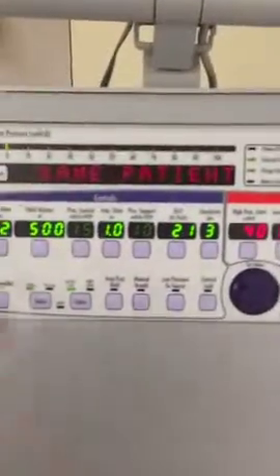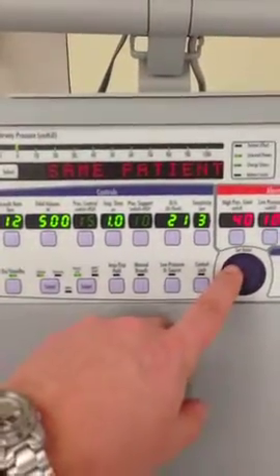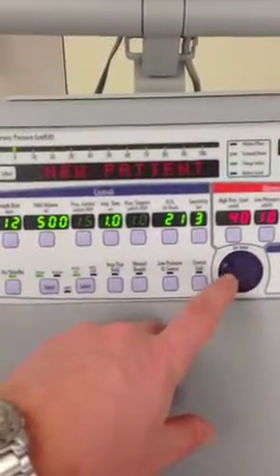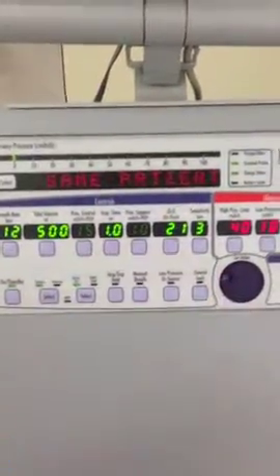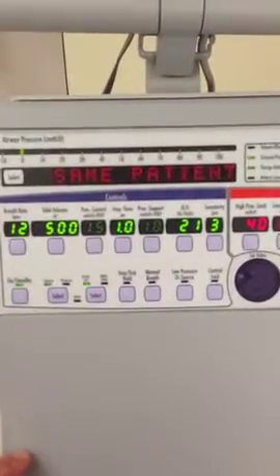Now I've got a choice. If we look in this display window, right now it says same patient. I can select my same patient, or I can select new patient by using this dial here at the bottom. If it's the same patient, you're going to be able to see what ventilation mode and parameters were already previously set. So down here you can see, zoom out a bit so you can see it better.